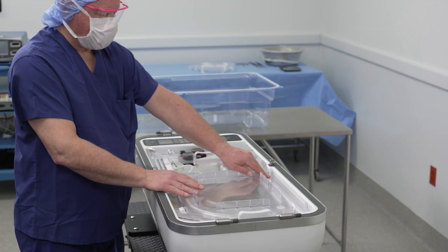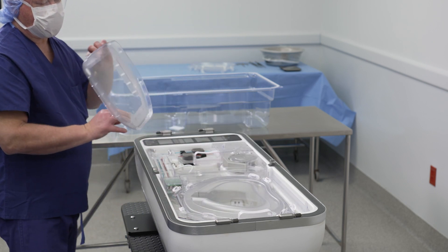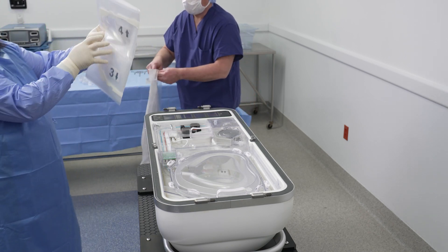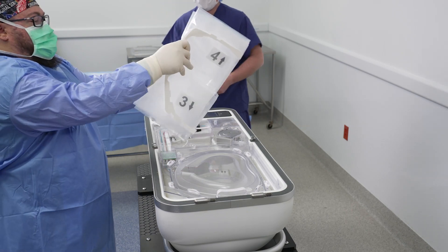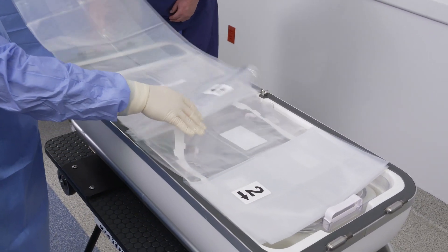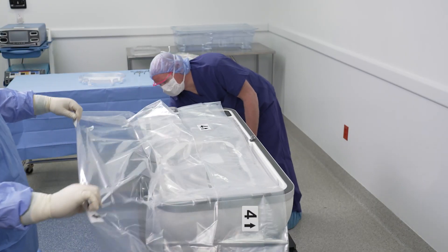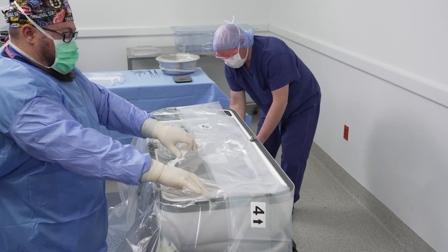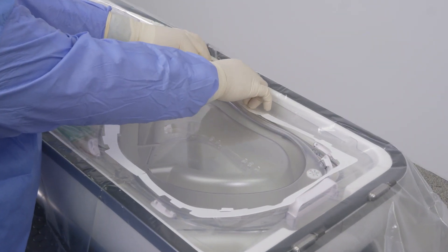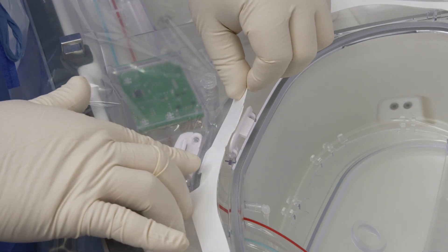A person outside the sterile field should remove the outer perfusion circuit lid from the organ chamber. Using standard aseptic technique, position the Life Port Liver Transporter disposable sterile drape over the perfusion circuit. Ensure the arrow on the orientation guide points towards the pump deck. Using standard aseptic technique, unfold the drape using the numbered labels and arrows. Position the drape gasket securely around the inner lid and place each tab of the gasket under each of the eight white latches.